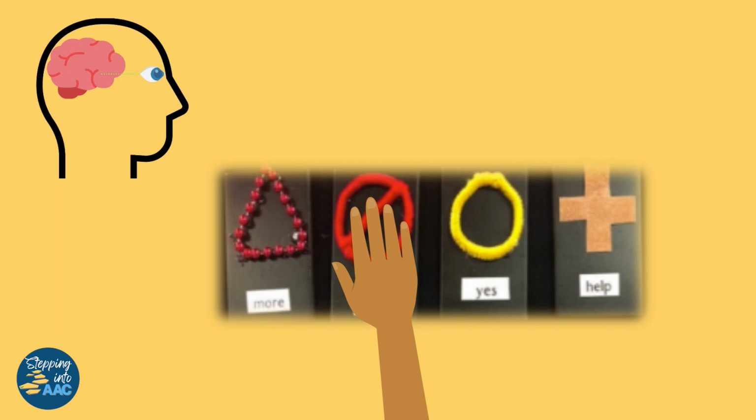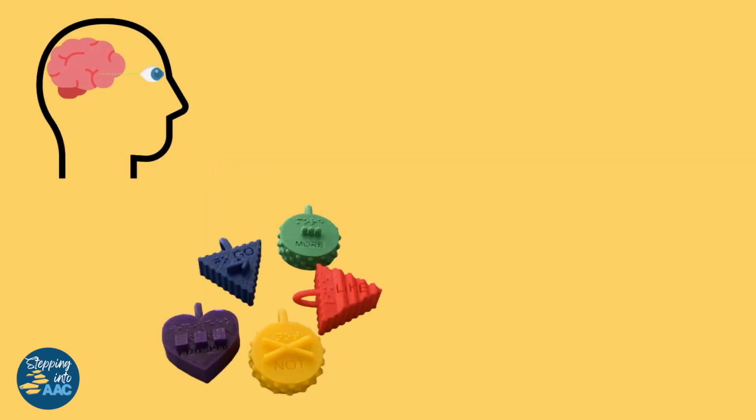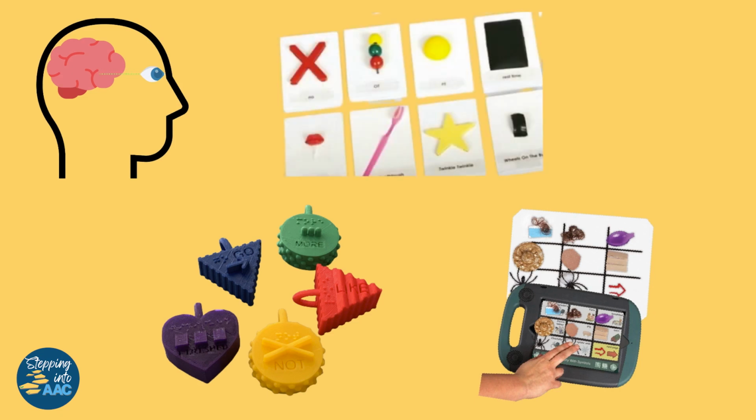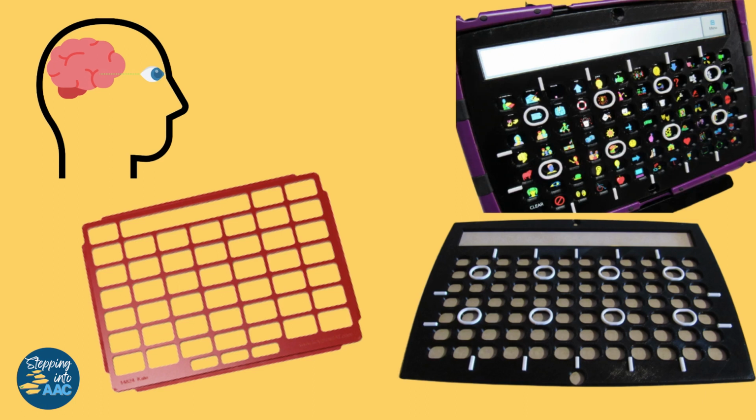Tactile symbols are another option, either as part of an AAC system or to facilitate learning about symbols. A few options include Project Core's templates for 3D symbols, Attainment Company's tactile materials for the Go Talk Now app, or American Printing House symbol kits. Tactile cues or guides around the edge or on the key guards can also be used to orient the AAC learner to the edges, center, or quadrants of their AAC system.